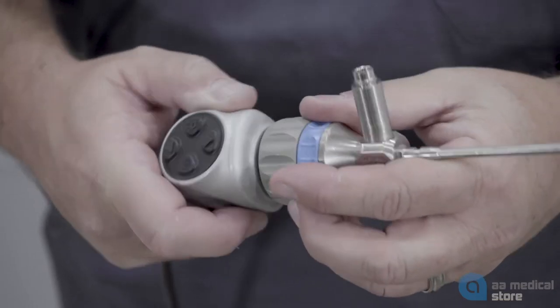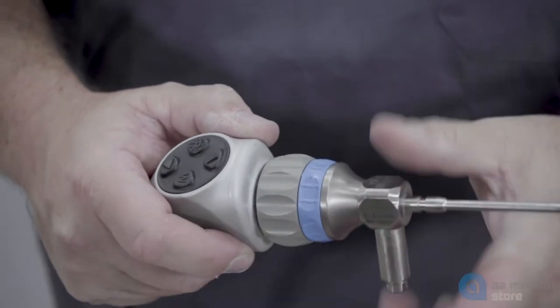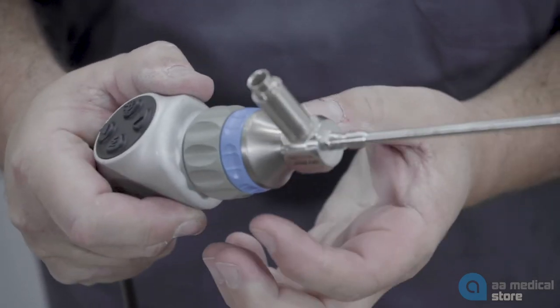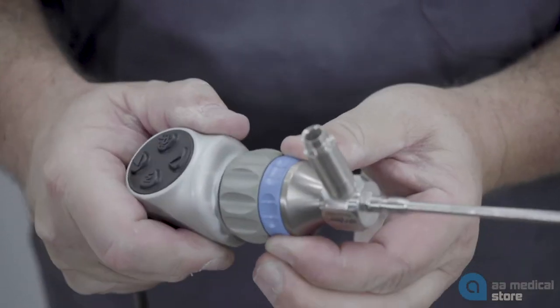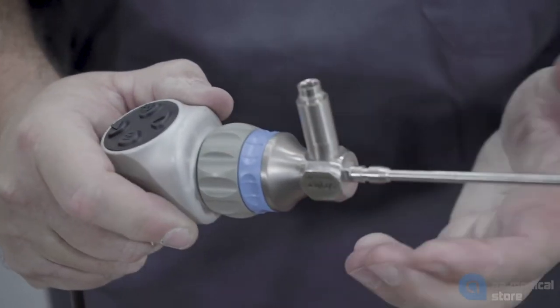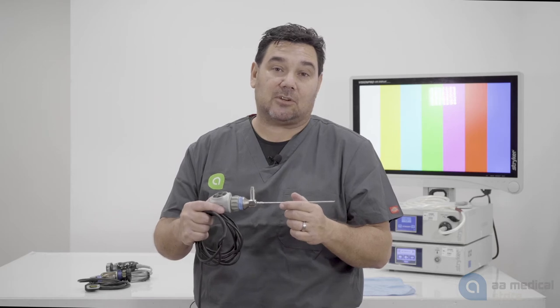These two will then join together and make a connection, or direct coupling as they call it. The nice part about the direct coupling arthroscope is that the focus ring is now on the scope and it wouldn't be on the coupler. So this is the example of a direct coupling arthroscope.